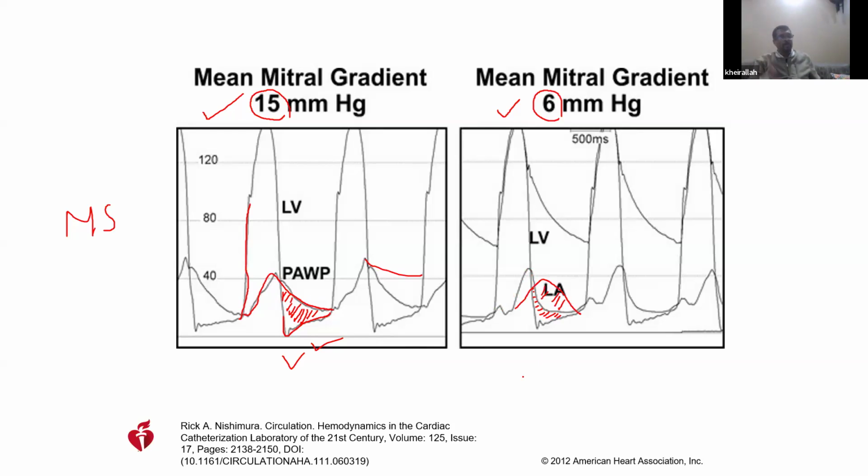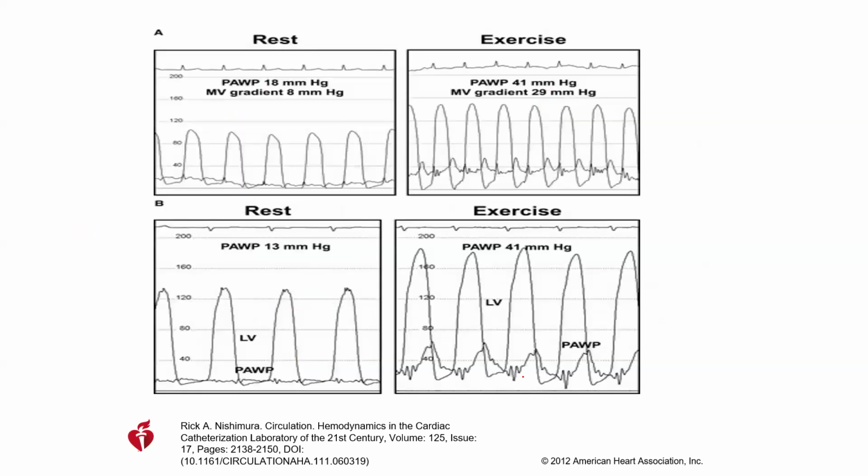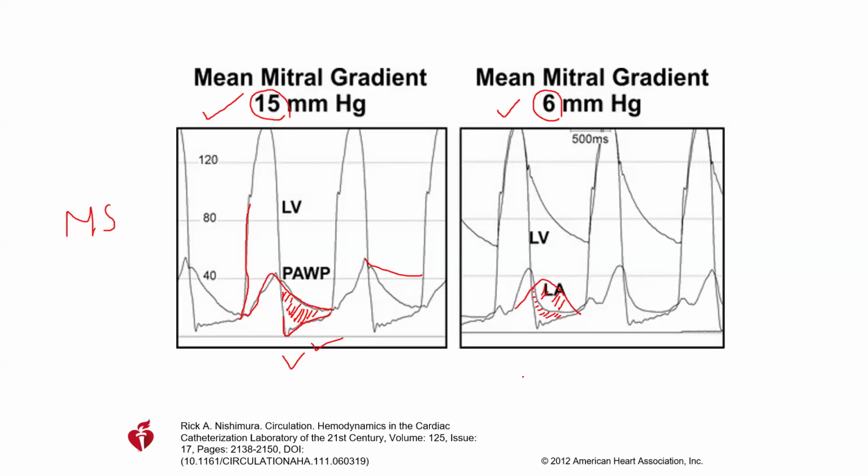Therefore, when you are measuring for mitral stenosis using the wedge, be careful about this time lag because it has a big impact on the accuracy of your measurement. So you have to be wary of this, and you correct for this time delay. Okay, fine. Now, Dr. Hatem asks: is the echo more accurate? Is the echo more accurate?